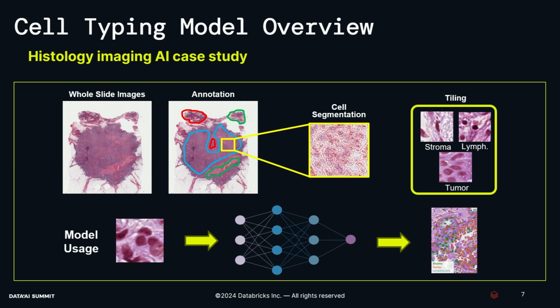We looked for a model that we could use and figure out how to actually get to production. This is a relatively straightforward supervised learning problem, split into 3 classes: stroma, lymphocytes, and tumor. Our lymphocytes are the immune cells that attack our tumors. Stroma is, in this case, everything else that's not tumor. But tumor is really important to understand, to know if we have enough material for our TrueSight Oncology Illumina genetic variant pipeline. We had our pathologists do non-exhaustive annotations. We're very grateful that we had some, but getting pathologists to do annotations is not an easy thing to do.